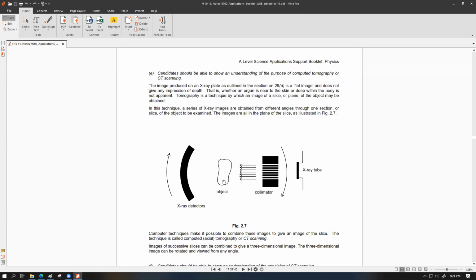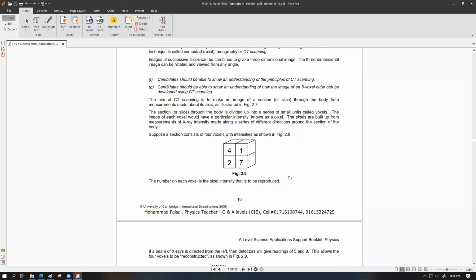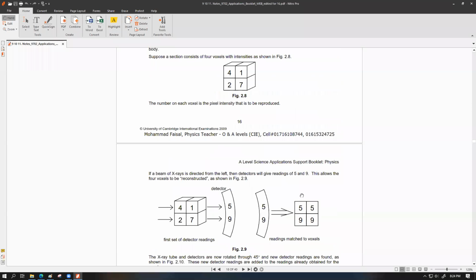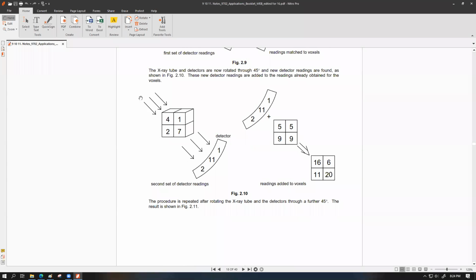So rather than keeping the X-ray setup fixed and rotating the patient, the patient lies down on the table and we rotate the setup, for the patient's comfort. So we rotate the whole direction of the X-ray sending, and we send a corner beam to this same voxel, and we're going to get 3 different readings.